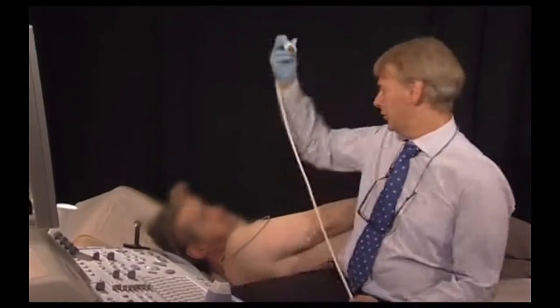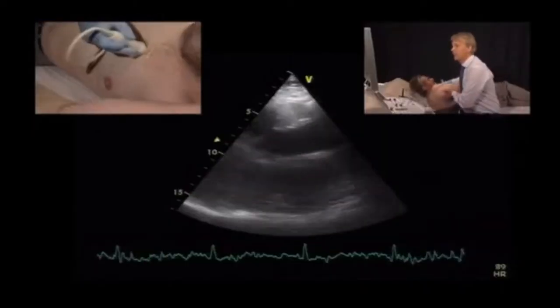Watch the following demo and you will see how we assess a patient with MR with respect to the mechanism. So the jet direction can give you very valuable information about the mechanism of mitral regurgitation. We'll start with the parasternal approach.